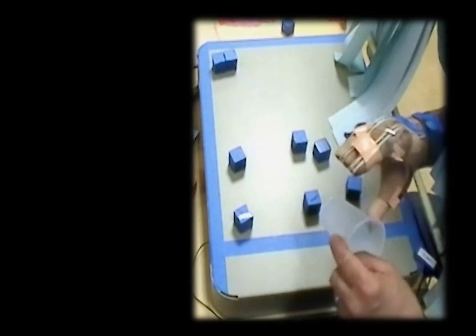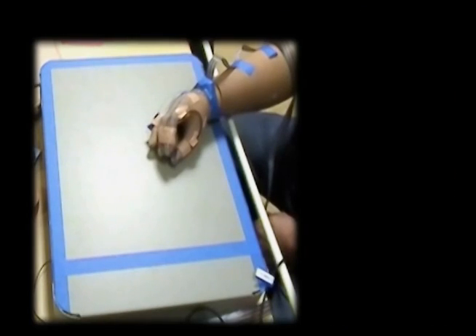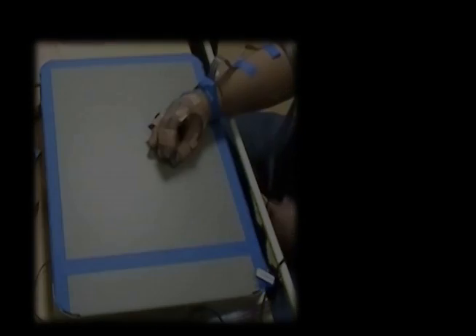Okay. Probably because of the way it's sitting on the thumb. Yeah. I think it's better. Is it preferable to have it? Oh, I'd rather have it. I'd rather have it in a heartbeat.